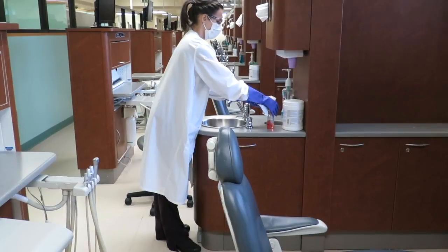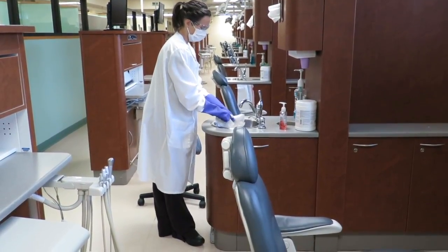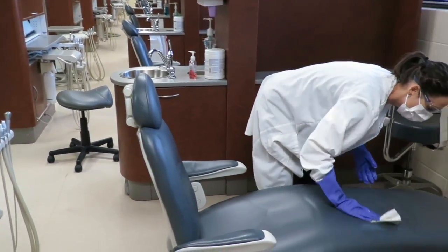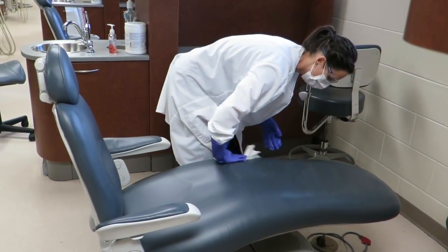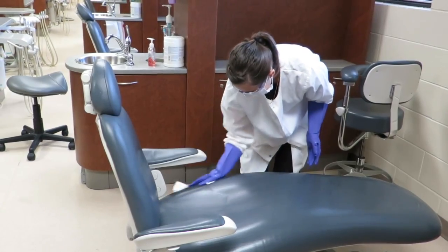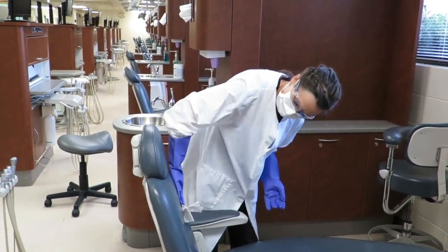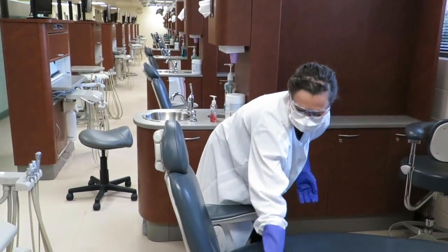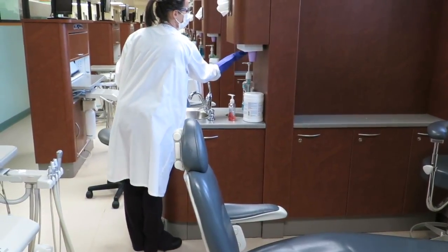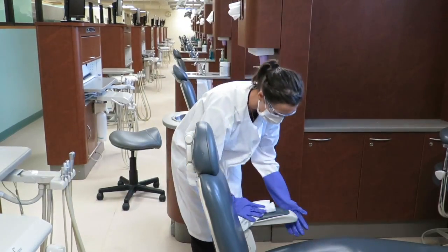In order to keep the patient chairs in the best shape for long-term use, we recommend using warm, soapy water to clean the chair instead of the disinfectant wipes. This will be used on the leather surfaces only. You may even need to have an additional wipe with only a wet paper towel to remove any residual soap.